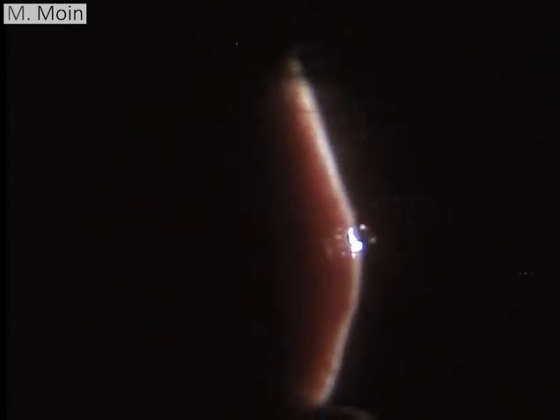So this is scleritis, and actually you can make a thin beam, and now when I'm going through you can actually see the thickness of the sclera in that area. So that tells you that this is scleritis and not episcleritis, and this is a nodular type of scleritis which is non-necrotizing and which is not involving the anterior segment along with it.